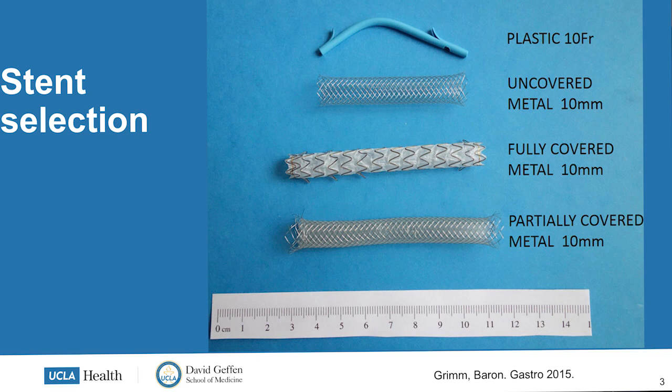And today I want to talk about the decision about stenting. It can be challenging. It's somewhat of a lonely decision. You may have just gotten through the big steps of cannulation, performing your sphincterotomy. Maybe you just got a diagnosis, and now it's a decision of what type of stent to place. Are you going to go with a plastic, a metal, what type of metal, what inventory you might have?